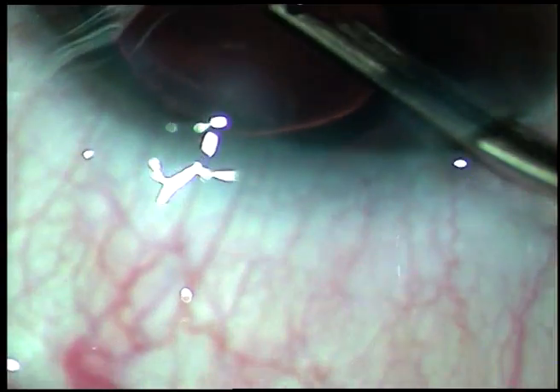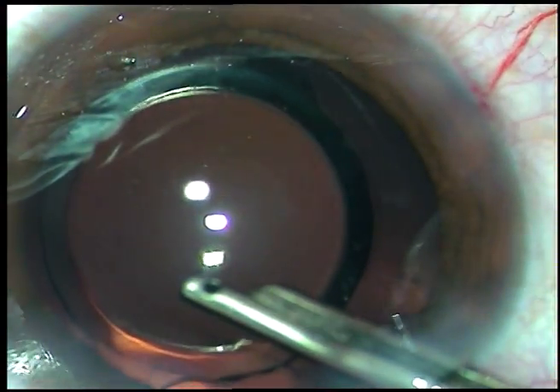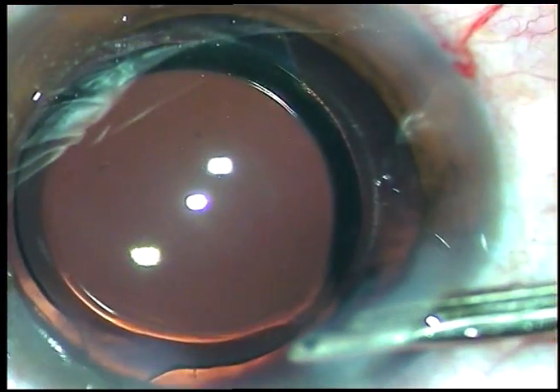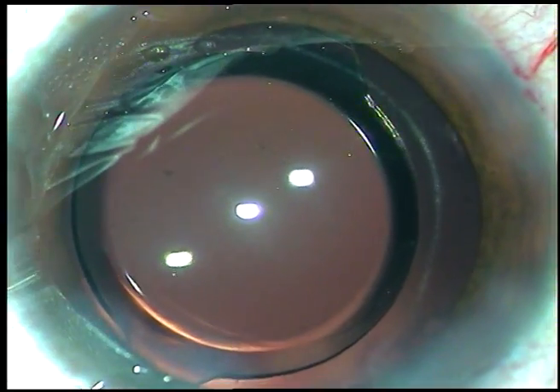That's it. Now, this is the final lavage of the anterior chamber — form the anterior chamber and conclude the case. Hope this video will help you in developing your surgical skills. Thank you very much for watching.